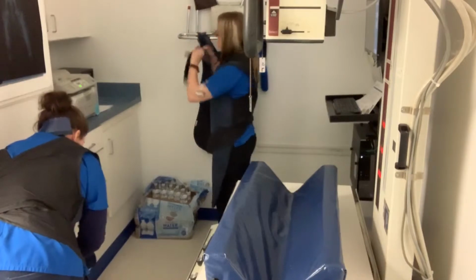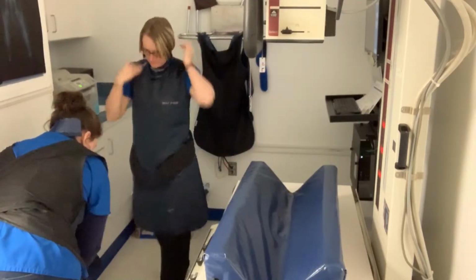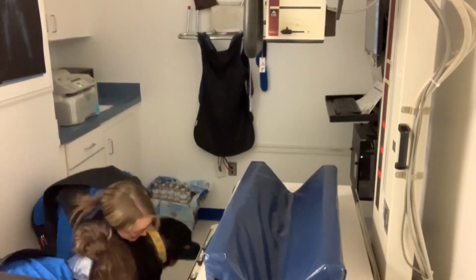Contraindications to look for are if the animal has a fluid-filled distended esophagus or stomach, if the bowel is atonic, or ileus due to torsion.